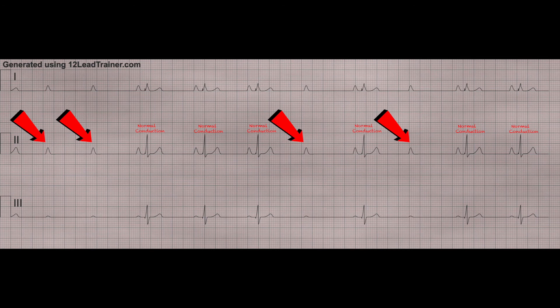Looking at the PR interval on this specific strip, it is normal, and the QRS complexes don't appear to be wide. The rate on this ended up being about 58 beats per minute, and you can definitely tell the atrial rate is faster than the ventricular rate. With these types of heart blocks, they can actually be extremely, extremely slow — which I'll show on a different strip when we talk about treatments.